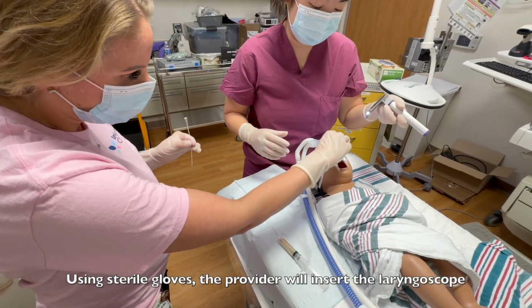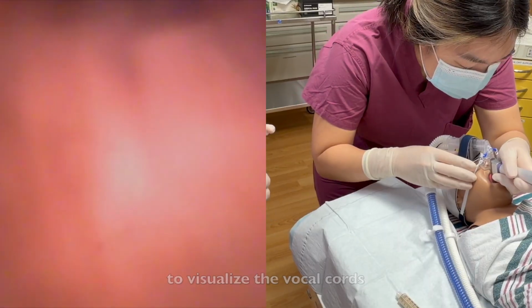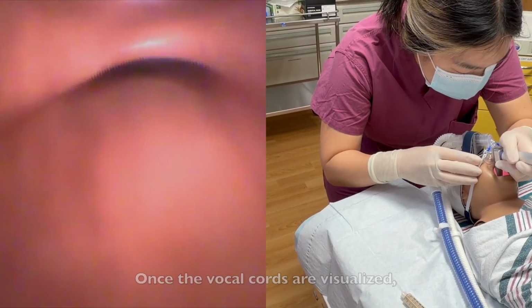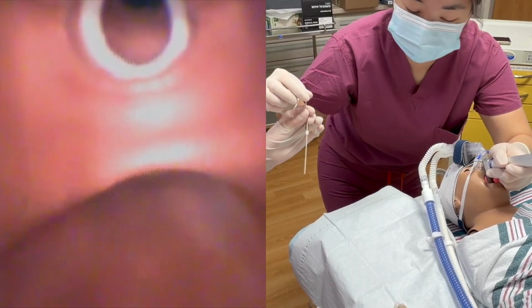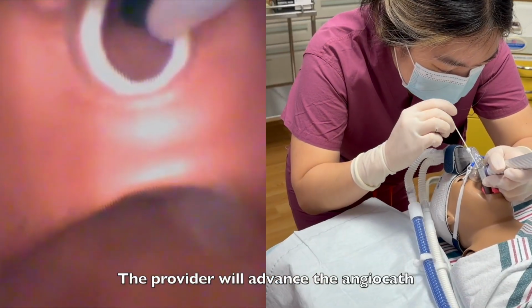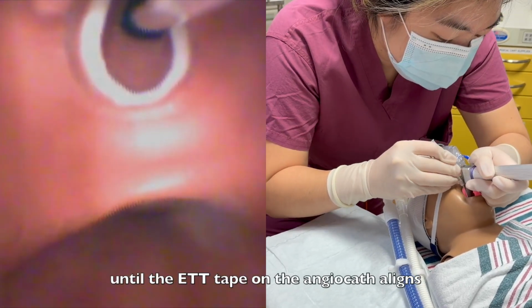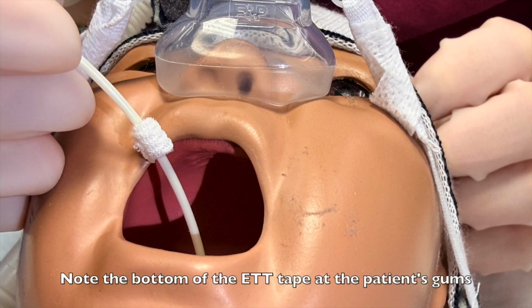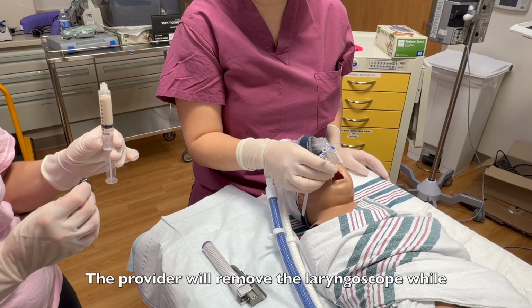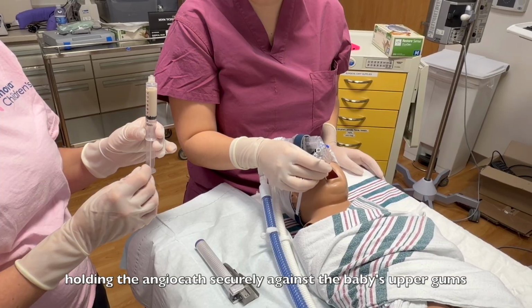Using sterile gloves, the provider will insert the laryngoscope to visualize the vocal cords. Once the vocal cords are visualized, the RT will hand the angiocath to the provider. The provider will advance the angiocath until the ET tube tape on the angiocath aligns with the patient's gums. The provider will remove the laryngoscope while holding the angiocath securely against the baby's upper gums.